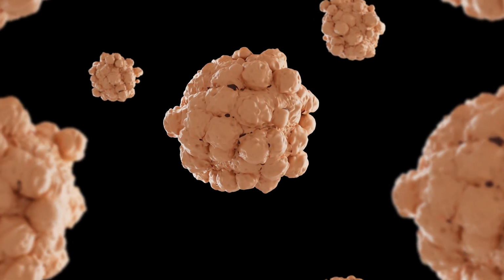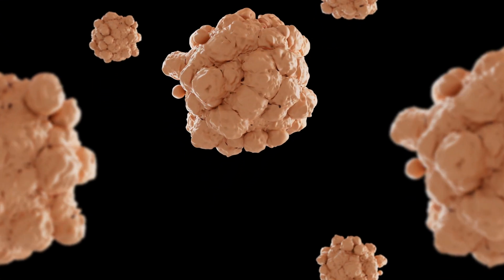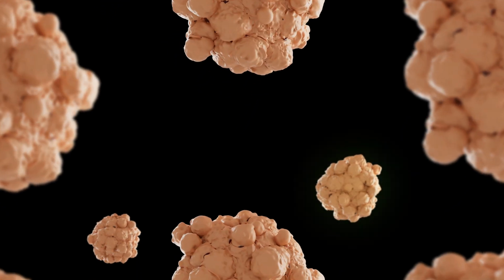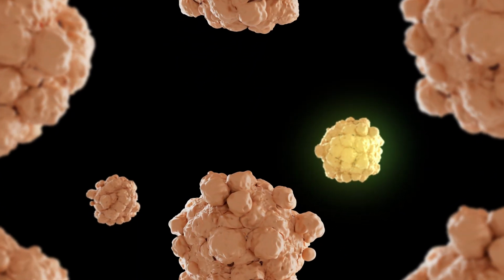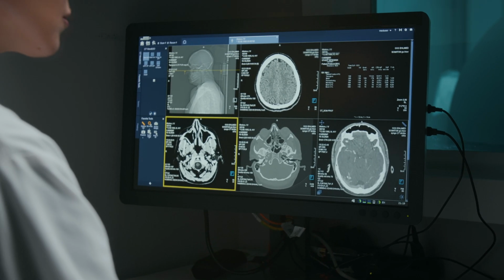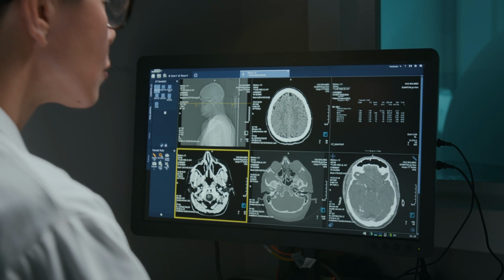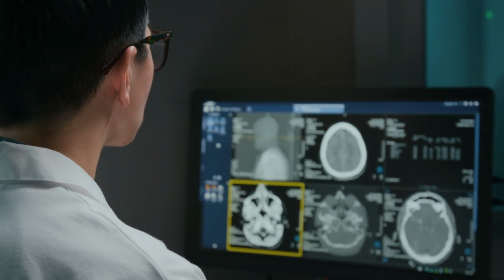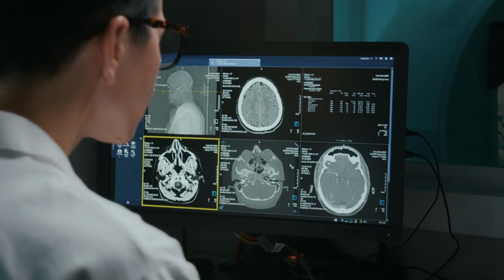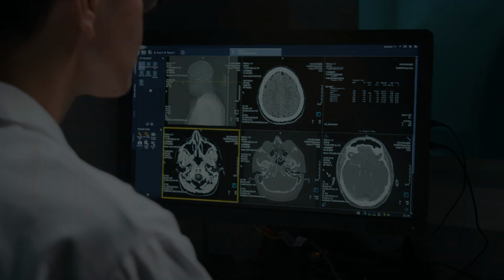Because cancer cells often consume more glucose than healthy cells, radioactive tracers can make tumors stand out, useful for both diagnosis and research. Beyond that, these tracers also help scientists study how organs like the brain or muscles use energy in real time. And that's just the start of what these tracers can reveal.